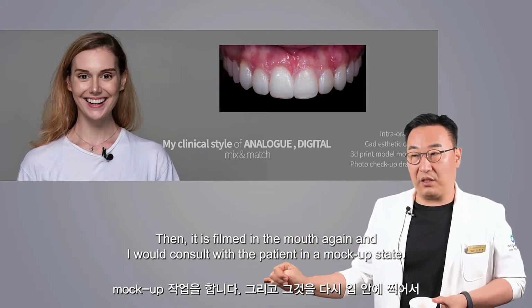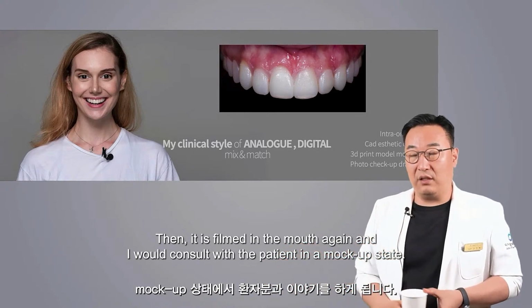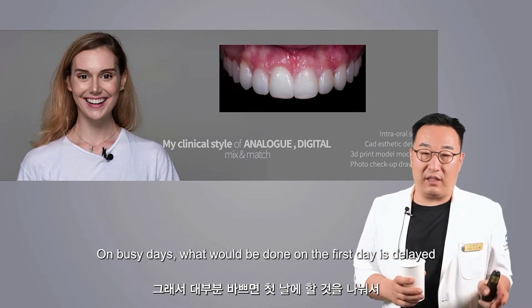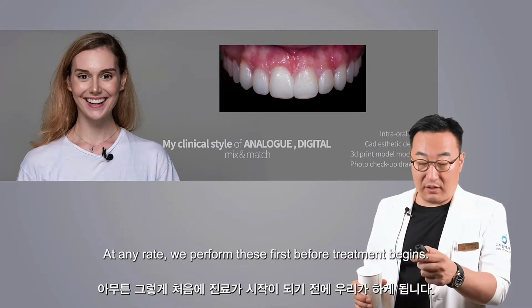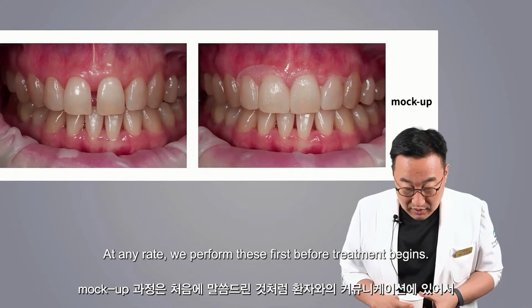in the dental lab. Then, it is filmed in the mouth again, and I would consult with the patient in a mock-up state. On busy days, what would be done on the first day is delayed, and the mock-up is performed on the second day. At any rate, we perform these first, before treatment begins.